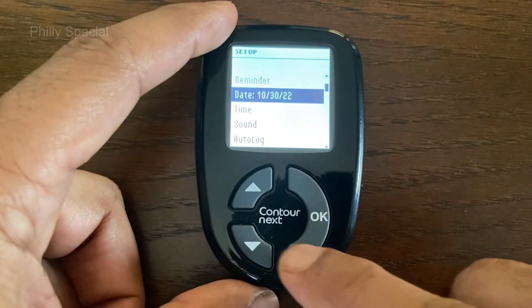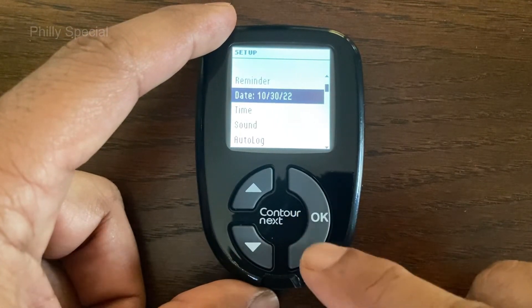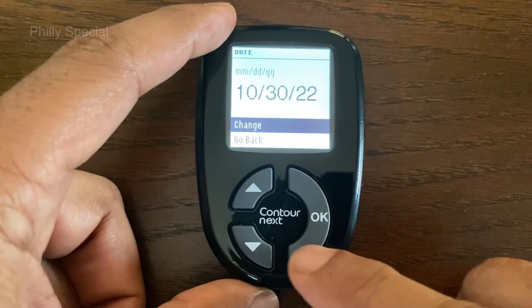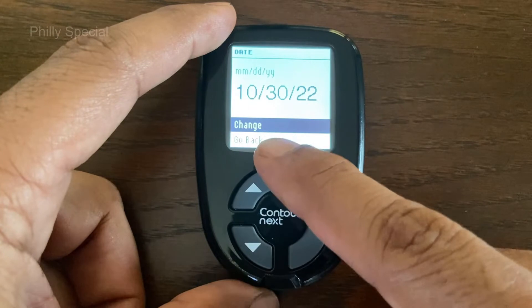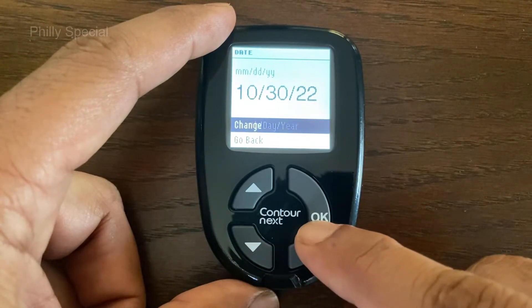On the setup menu, using the arrow button highlight the date option and press the OK button. Change will be highlighted. Press the OK button.